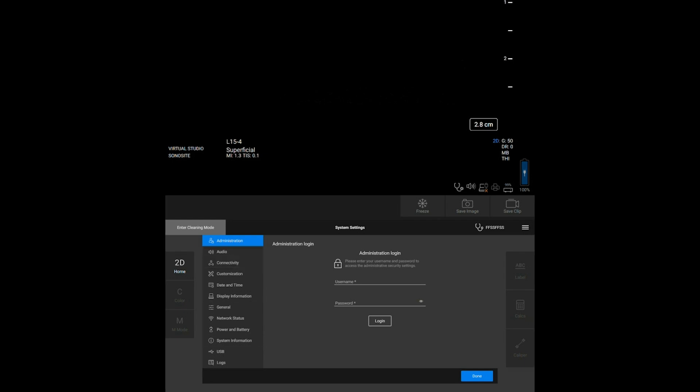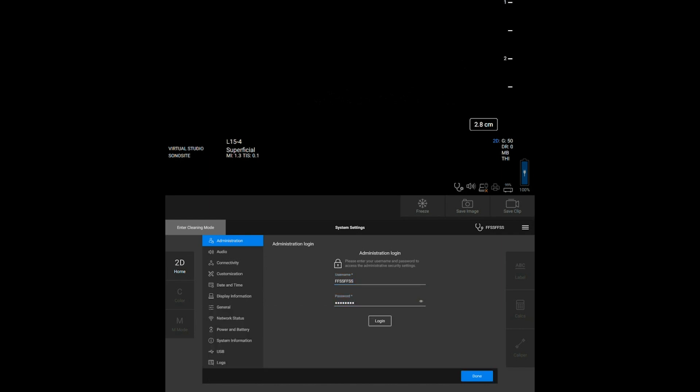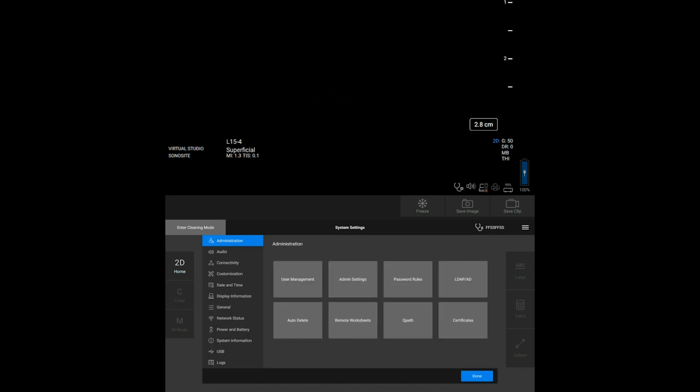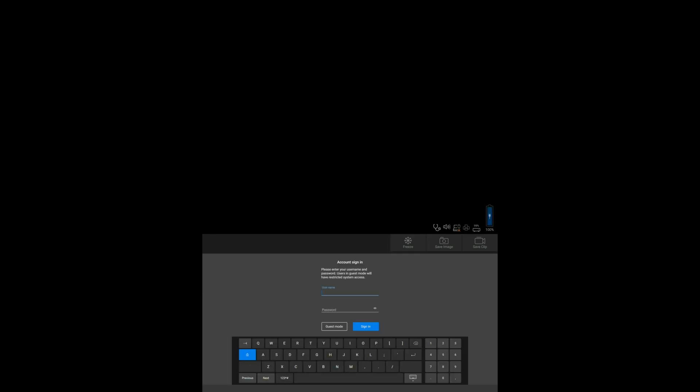To add new users and update their information, you'll need administrator access with the proper login information. With this access, you can also require users to login to the system with a password to protect patient information.